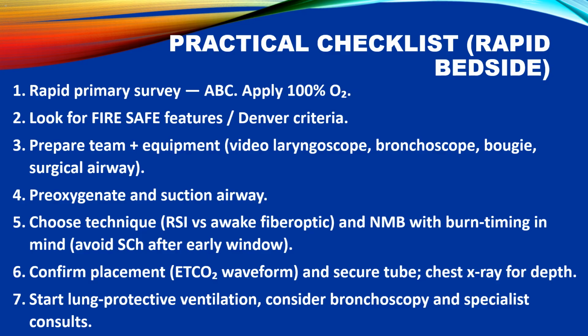6. Post-intubation care. Confirm endotracheal tube placement using ETCO2 waveform. Secure tube. Secure the tube and obtain a chest X-ray to assess tube depth. 7. Lung protective ventilation. Initiate lung protective ventilation strategies. Specialist consults. Consider bronchoscopy and specialist consults as needed. This practical checklist can help guide healthcare providers in managing the airway of burn patients, ensuring a systematic and effective approach to intubation and post-intubation care.